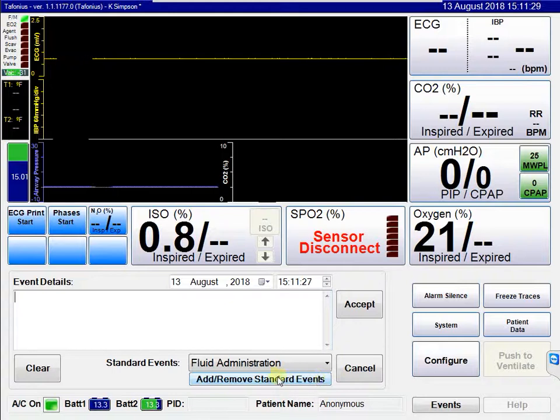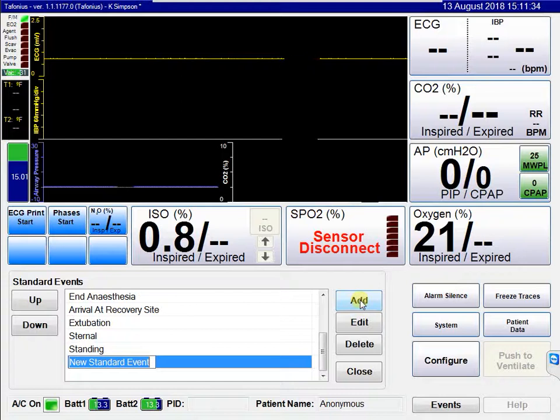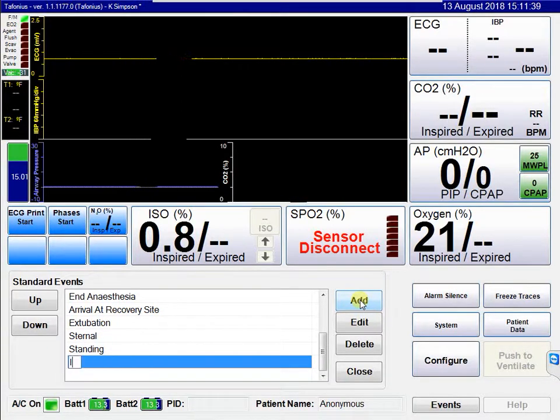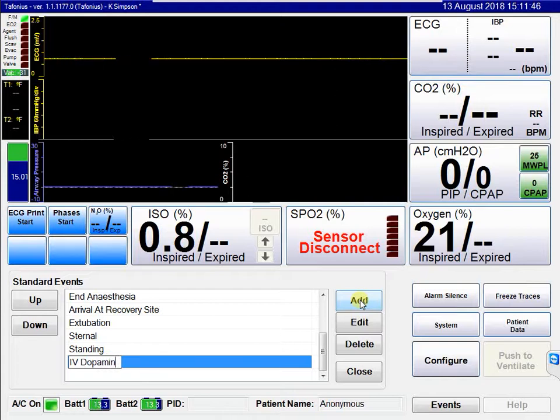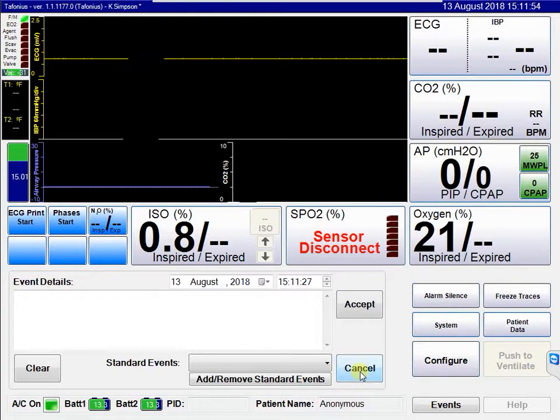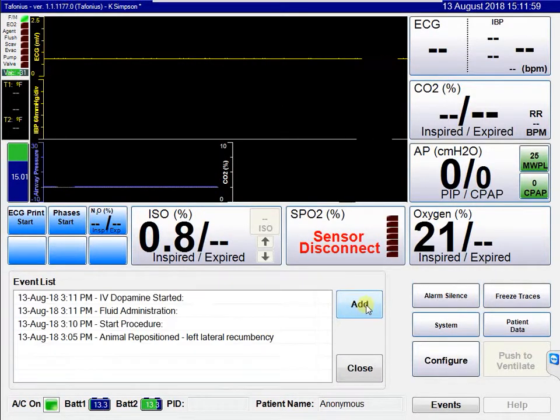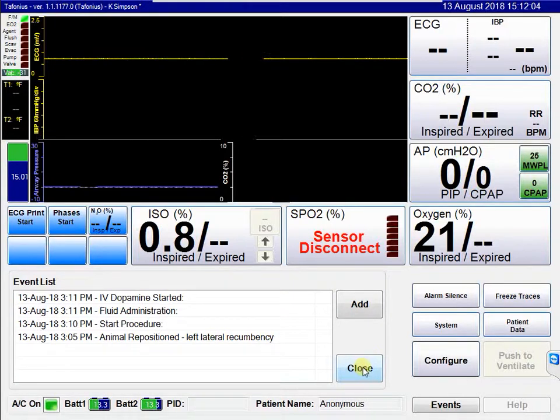If you want to add your own standard events, click on add/remove standard events, then click add and enter a new event such as IV dopamine started. Close, and this will now become one of the standard events. All events will appear in the anaesthetic record at the end.